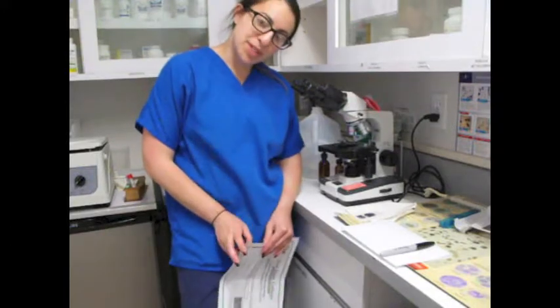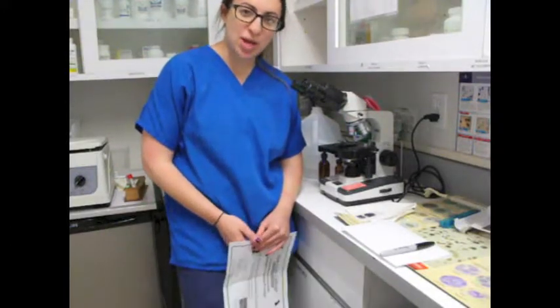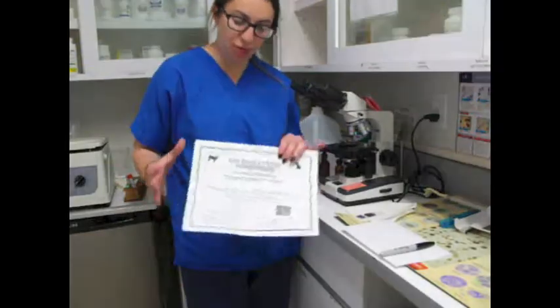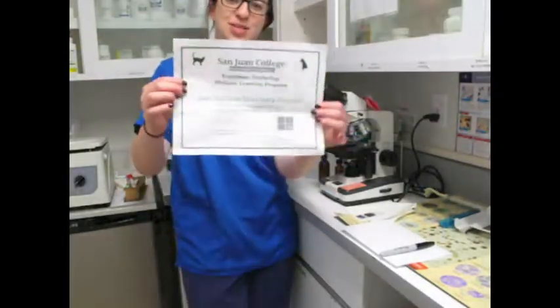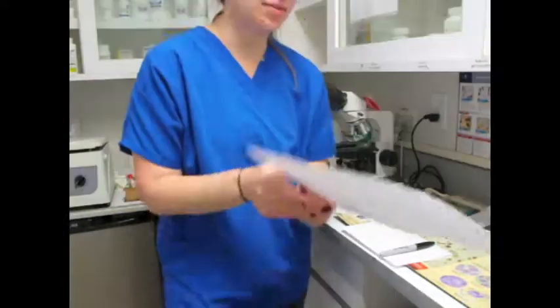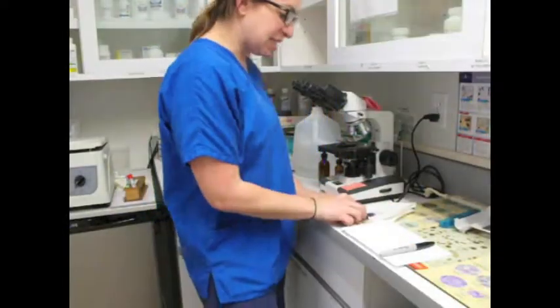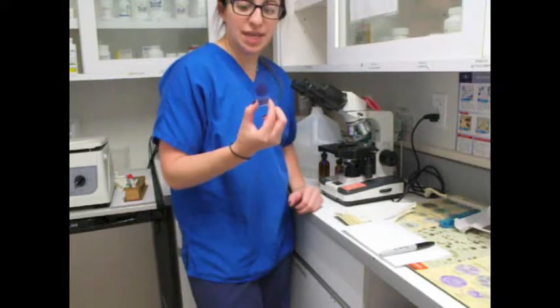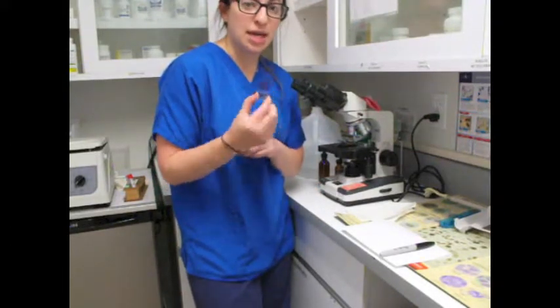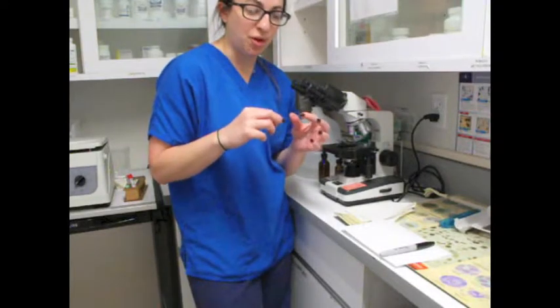Name is Nicole Bruno, and this is task number 4, perform a microscopic examination of a blood film using the Leukocyte Differential. So first, this is my OCCI certification, which hangs on that wall right there. So I have my slide that I have already previously stained. It has a nice feathered edge and monolayer, which is where I'll be taking my readings from, my differential.